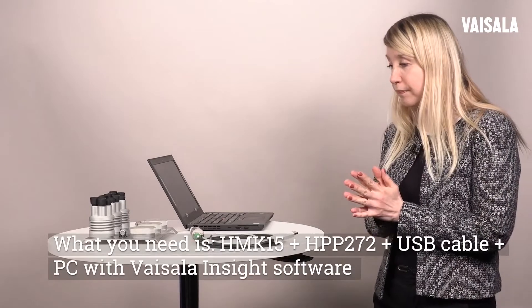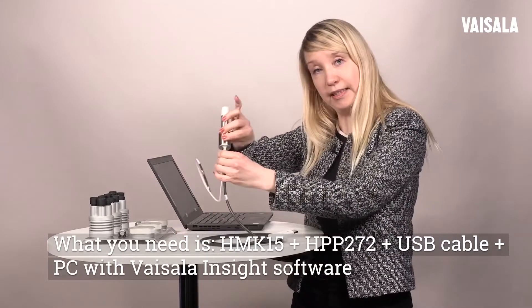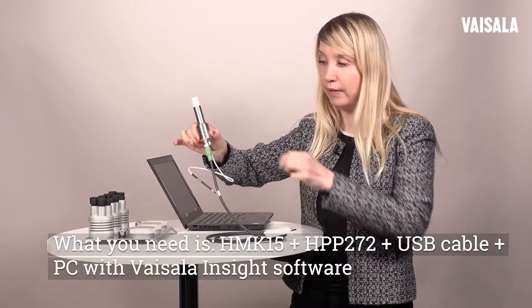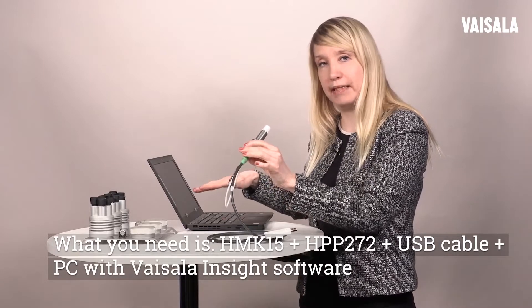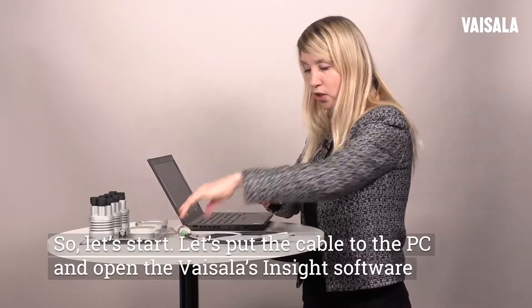What you need is HMK15, the probe — HPP-272 is what I have here today — and then the cable to connect the probe to the PC with Vaisala Insight PC software that you can download from Vaisala.com.